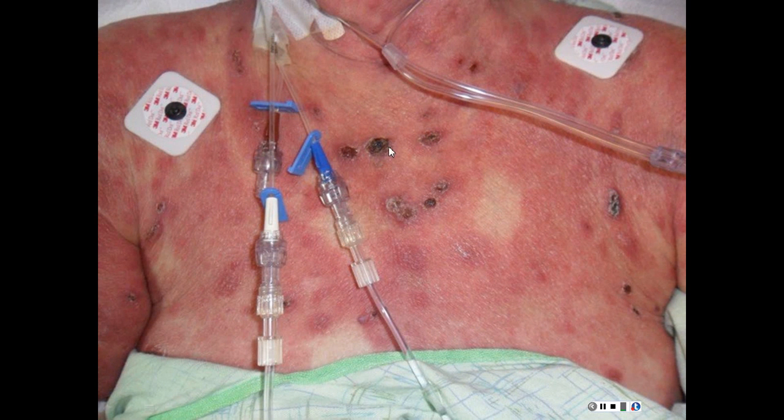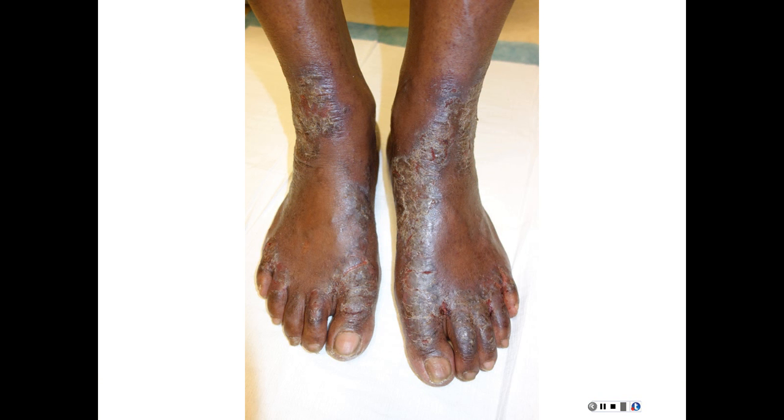For the MF type category, the necrosis was a little bit incongruous with MF, but for a cytotoxic lymphoma it would make sense. Okay. How about this one?